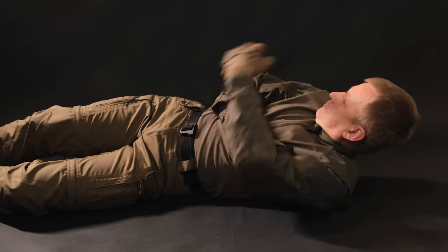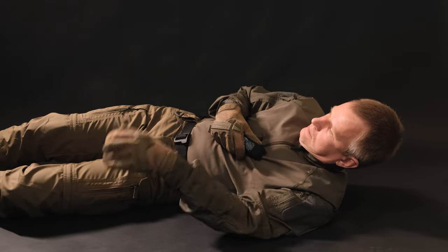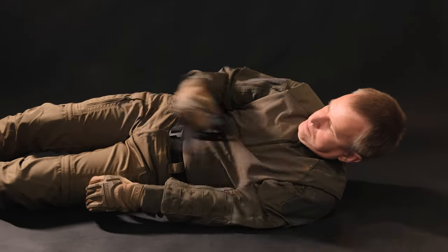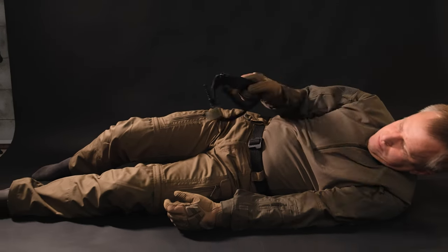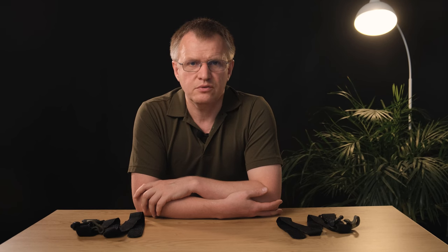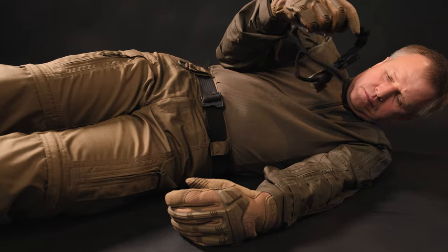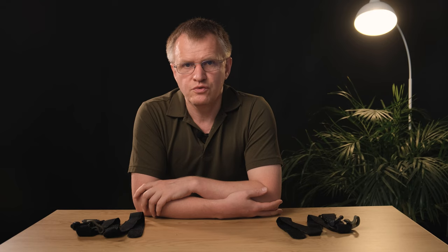Therefore, I am going to explain the general method of packing, but with an emphasis on self-help. Generally, when we use the well-known method of folding a tourniquet into a ring by shaking it, and only one upper limb is functional, the process becomes quite difficult. You may not have enough room to maneuver, the tourniquet may fly out of your hand while shaking, or you may not have enough strength and the tourniquet will open only slightly.